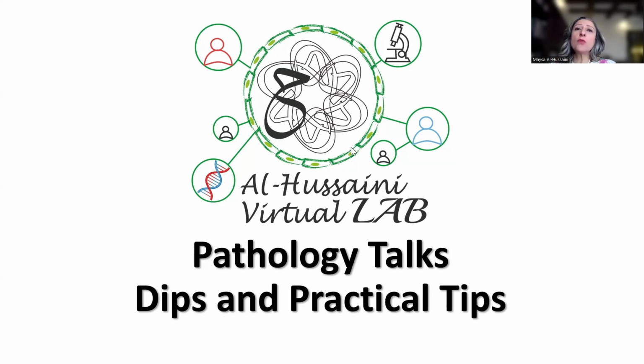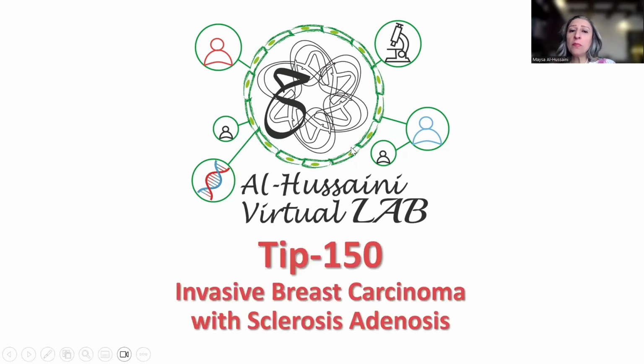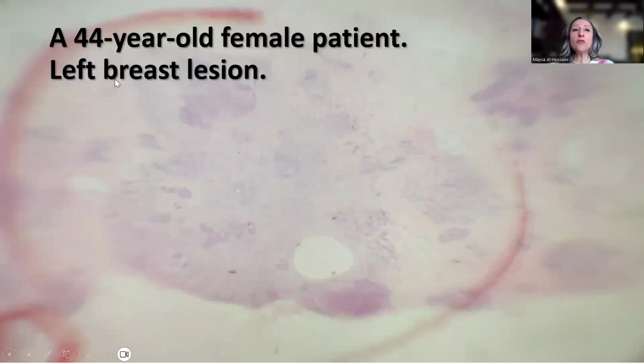What I'm going to be sharing with you today is a nice example of invasive breast carcinoma, ductal carcinoma, associated with sclerosing adenosis, a potential pitfall. So this is a case of a 44-year-old female patient who was found to have a left breast lesion. Even on imaging and the initial biopsy from the breast mass, or the breast lesion, was negative, but because of the irregular appearance of the breast lesion, they elected to go for an excisional open biopsy.